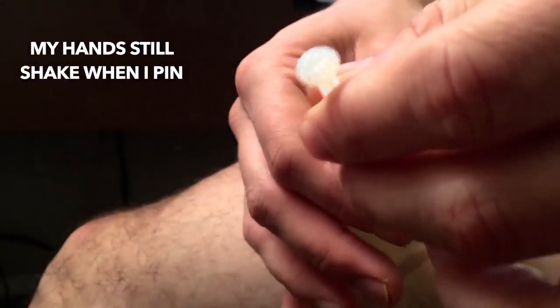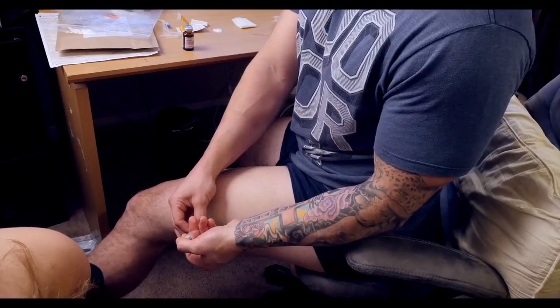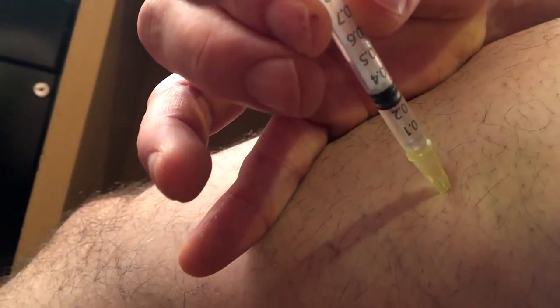The most important thing you can do is aspirate — you just pull back. You can see there's an air bubble that just goes away. You want to make sure that no blood is in your syringe. It's very unlikely that you would hit a blood vessel, but if you did, that would be a problem because it could eventually get stuck in the capillaries of your lungs.